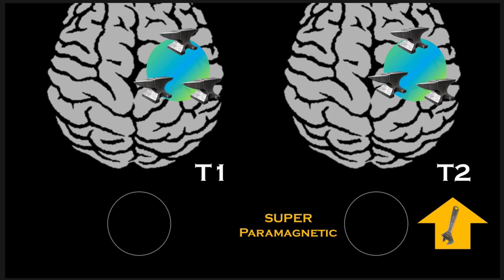Now, the one thing that I left out here for completeness is that in the center of a chronic hematoma, you usually have some water content, and that will often make the center bright also. So the pattern that we're describing in the chronic state is more of a rim pattern.